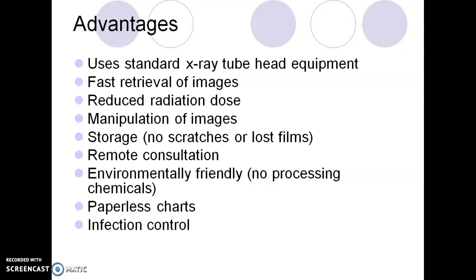Infection control is one of your advantages because you're not having to carry contaminated films from your exposure room to another room to be processed.